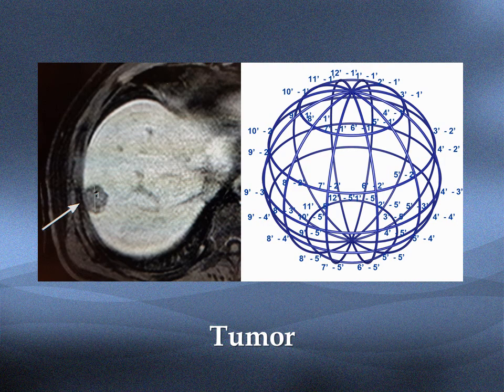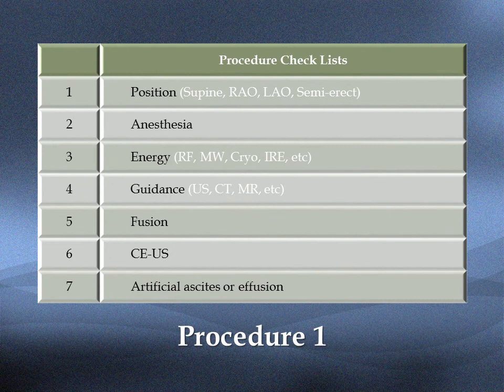Think more about the tumor in 3 dimensions. If so, you may realize there are so many innumerable technical options. Final step is the detailed planning for the procedure.